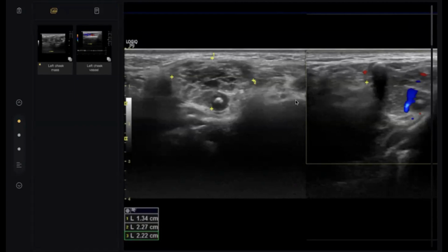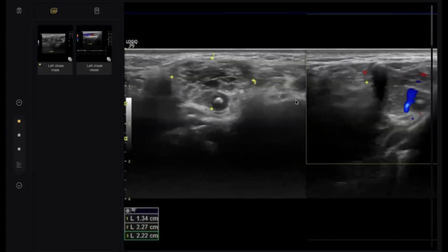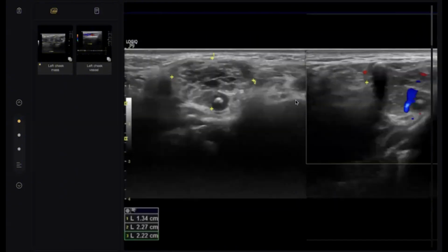This mass lesion contains a hyperechoic structure, but I cannot see any acoustic shadow, so this is not likely to represent a stone. I can see soft tissue swelling. In the color Doppler, I did see color uptake, so this makes it a vascular structure. I will compare the left side with the right side to see if there is any difference.